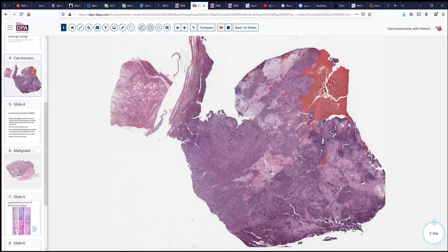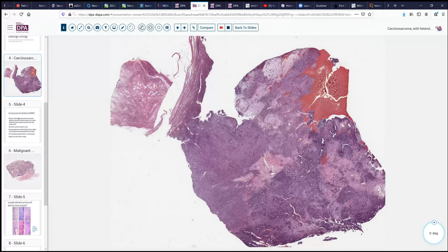Here's a representative section of her tumor, which was a bulky tumor in the endometrium and quite deeply invasive into the muscle. At low magnification, we see a couple of things that are quite striking. One is this very sieve-like glandular nested pattern in some areas, but other broad areas where it's more solid, interspersed with a different sort of morphology — more myxoid and more eosinophilic. So there seems to be a heterogeneous composition to this tumor.